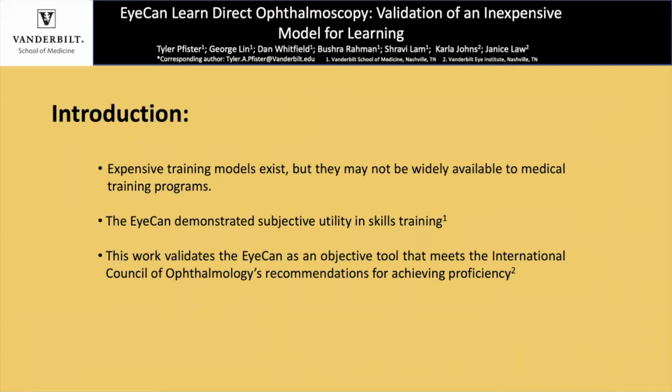But what we're looking to do with this study is to objectively assess it and make sure that it meets the recommendations by the International Council of Ophthalmology for achieving proficiency in the skill of direct ophthalmoscopy, namely being able to achieve focus and also recognize key pathology.